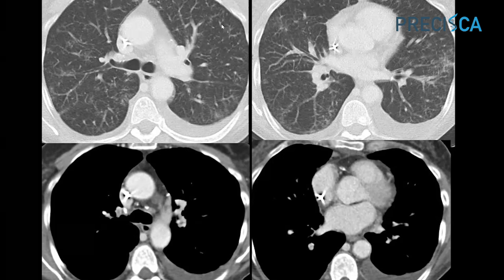You know that they're vascular because they're branching, and there's no air trapping to suggest that it's an airway that's filled. What can also be useful is sometimes to look at the right heart. In this case, the right heart was not that enlarged, but this patient very quickly developed an acute pulmonary hypertension and eventually expired from this embolic disease.